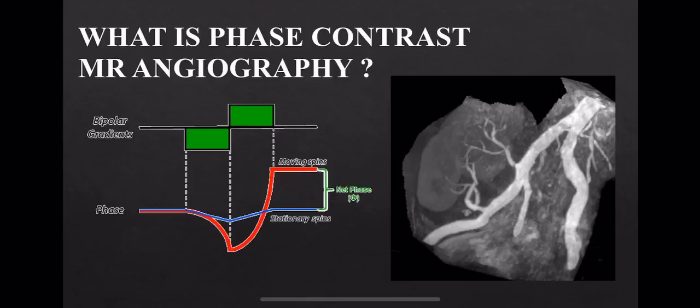Regular MRI uses both frequency shifts and phase shifts to record the position of protons within the slice. While frequency shifts depend on an actively applied gradient, phase shifts are remembered by protons. Thus, if we can somehow program protons to remember their phase related to how fast they were moving, we can read that out later to determine the velocity.